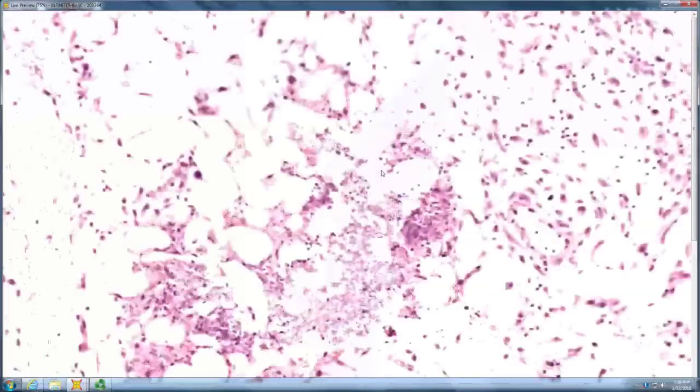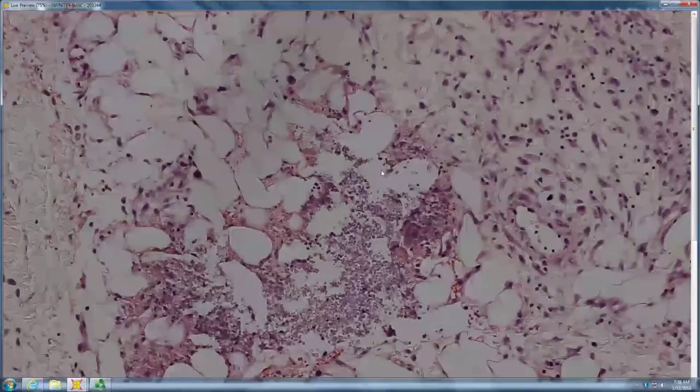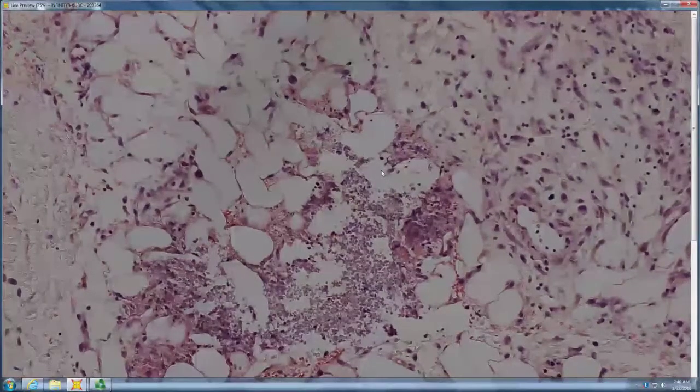So basically a Candida abscess, you're just starting with neutrophils here. But you're in the subcutaneous tissue, and there's just this mass of Candida organisms. So that was one of our patients here not that long ago. Okay, let's go.